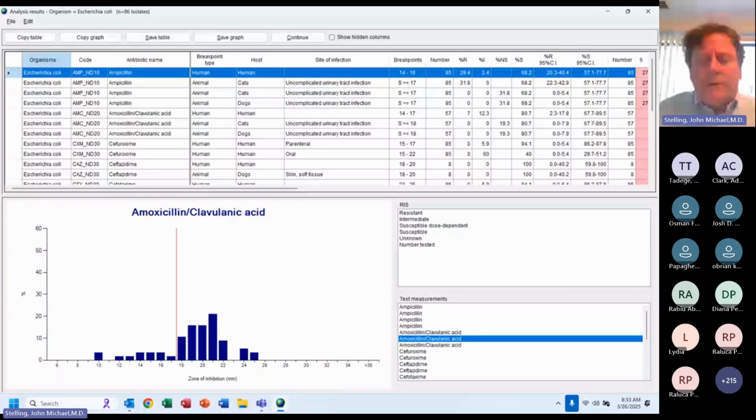Okay, great. So now I was showing you the Excel. Excel has some advantages. It looks better. Nice formatting. Also, it can be automated. If you have 10 analyses, WHONET can run them all at once and send all of the results to Excel, and you can have 10 sheets in Excel. You can do that manually once a month or automatically every day. We like to set things up, automatic analyses, automatic email alerts. So I'll talk more about that later. Okay, I'm now going to go to the next area.